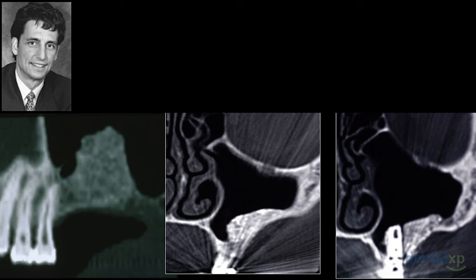This is another one. This particular one came from ENT because she was having issues that they thought were sinus, and in fact, it was just a mobile implant, and it was a dental origin. But when you take the CT scan, it's pretty clear that nobody had taken a CT scan to evaluate the poor bone grafting that had been performed. That sinus lift obviously had not been done properly, and that's something that could have been picked up prior to placing the implants.